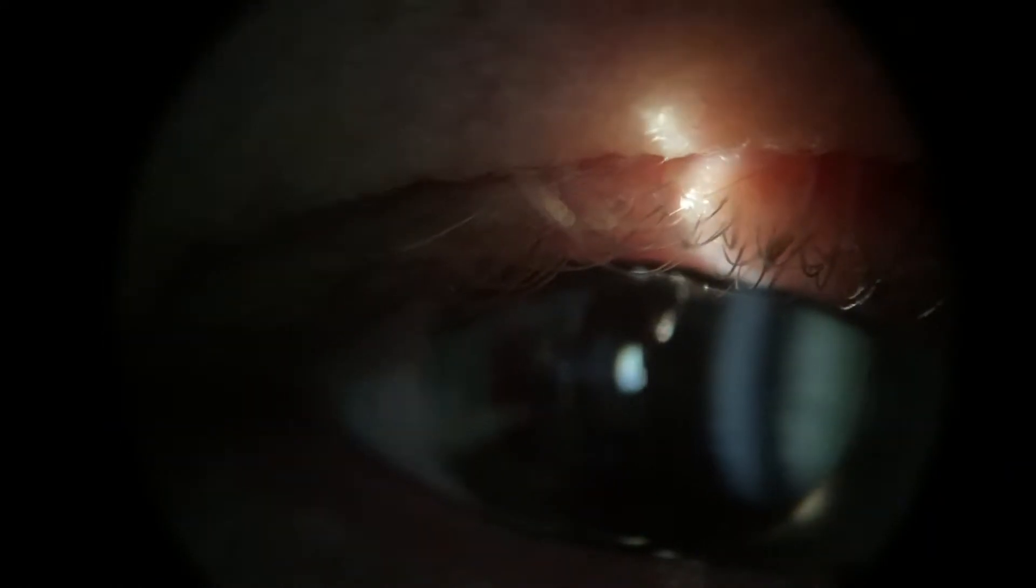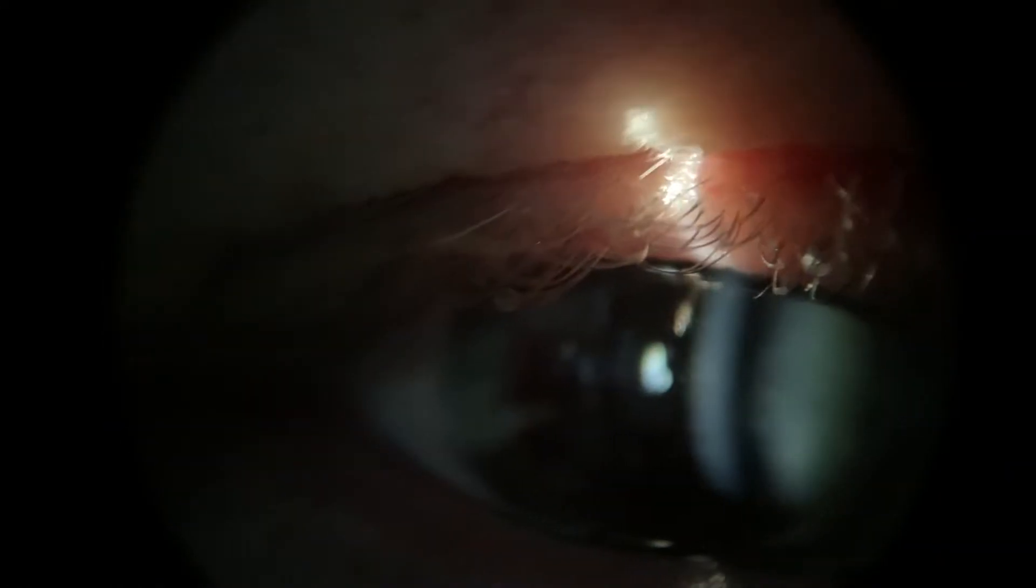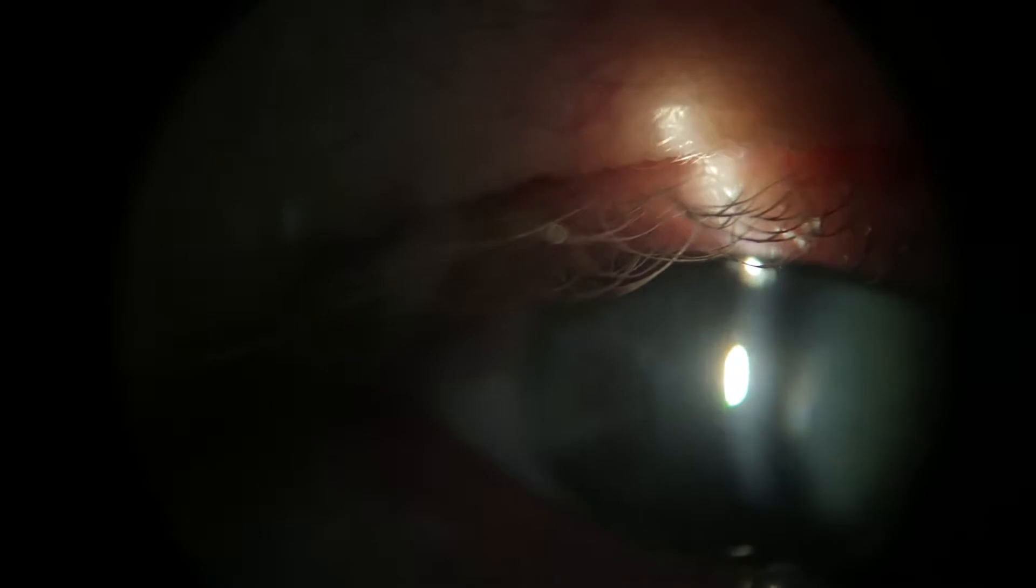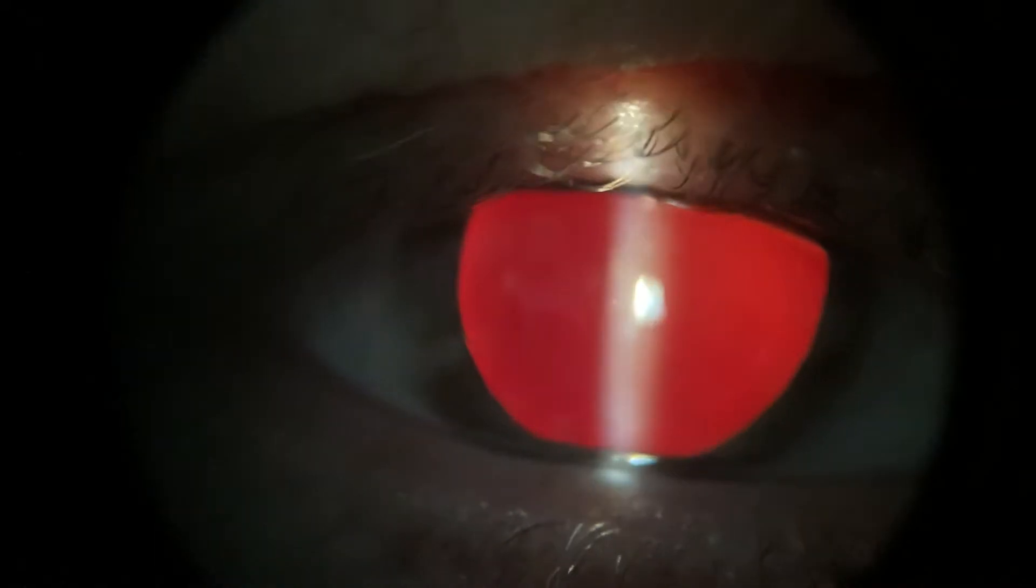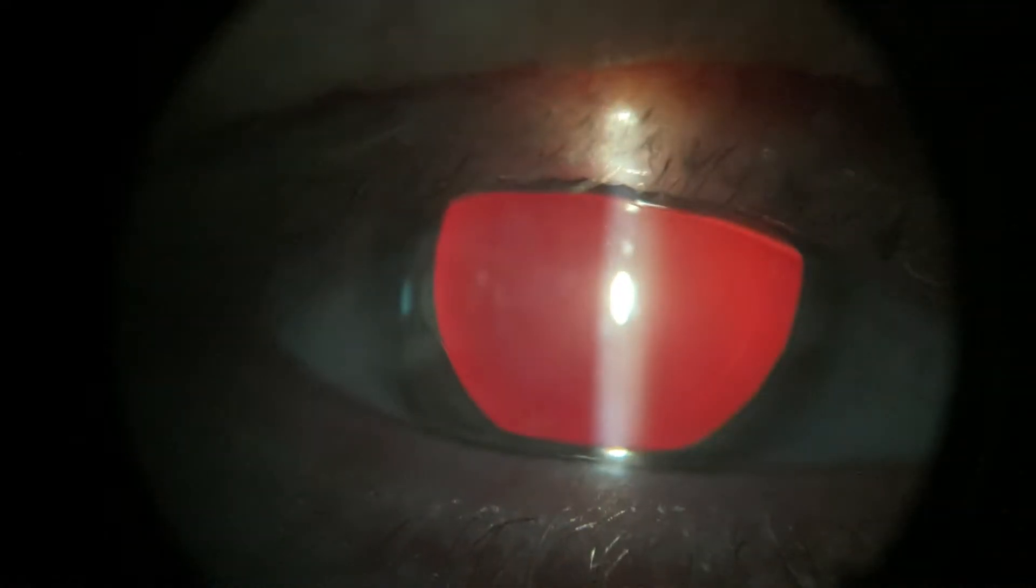Looking anterior to posterior, looking at the lashes, everything looks fine there. No significant blepharitis. Let's have a look at the upper lashes as well. That's great, everything looks fine there.